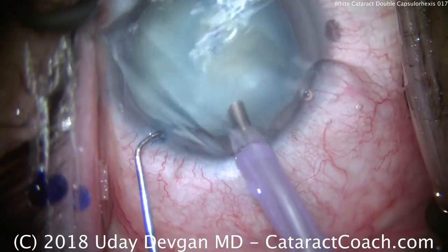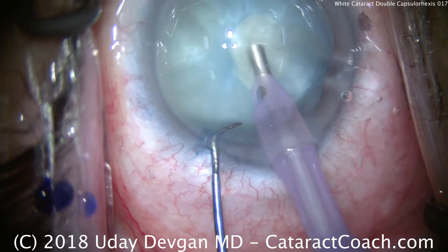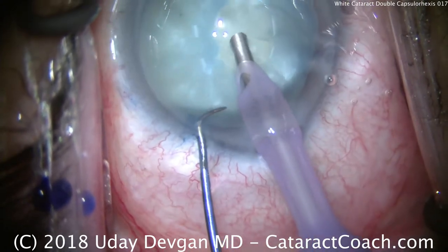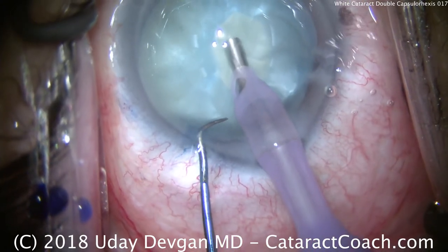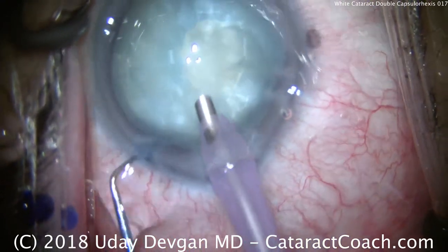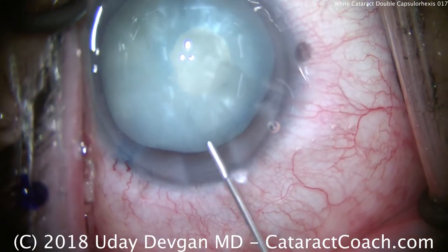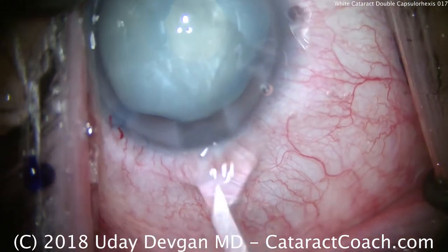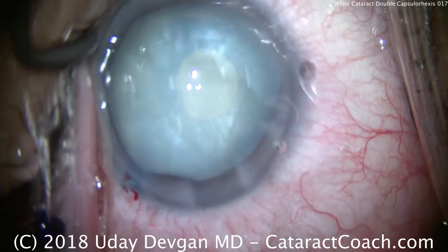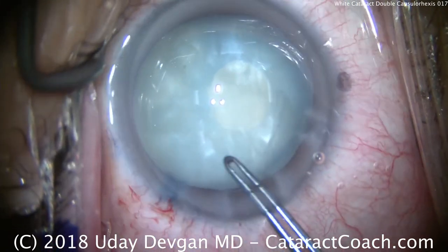So we'll now put the FACO probe in the eye. We're not going to do FACO through the small incision — we're just going to aspirate. Going in that hole and aspirating out, let's get out any fluid that may be remaining in there. That's enough. You could have used the IA probe as well. Now more viscoelastic will be put in the eye. I am absolutely sure that the pressure within the capsular bag now is very low.